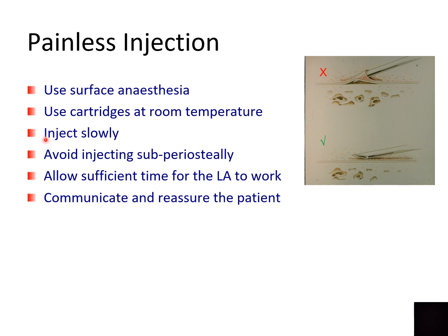And as discussed in the previous slide, it's very, very important that you inject slowly and that you explain to the patient before you start administering the LA that you would be injecting slowly, as it would help minimize the discomfort they might experience. Now, this one is really, really important.